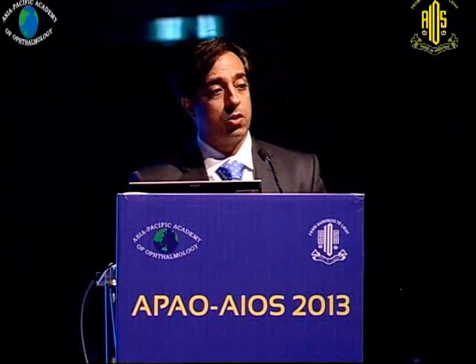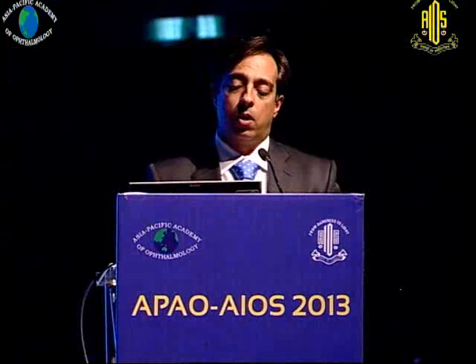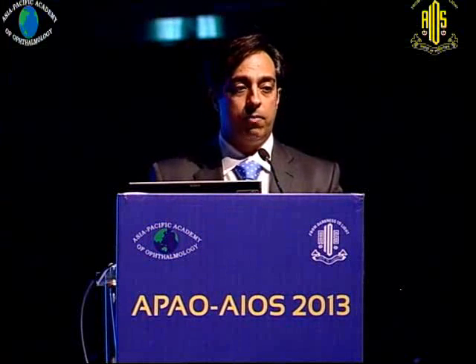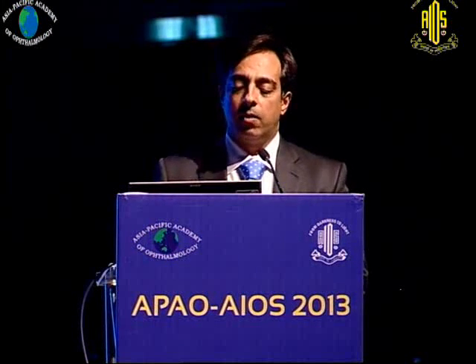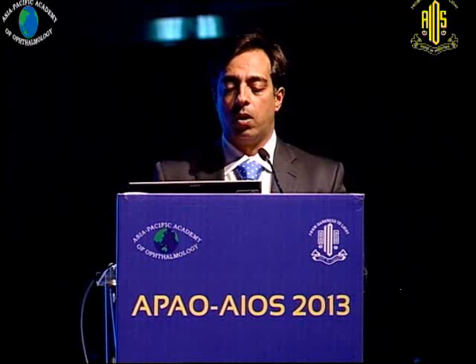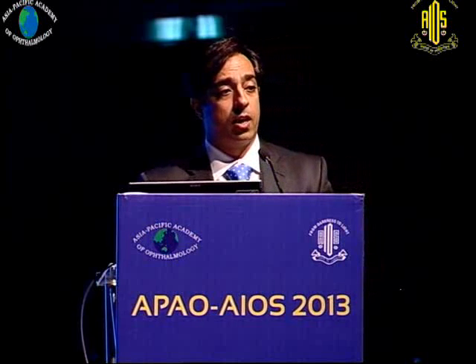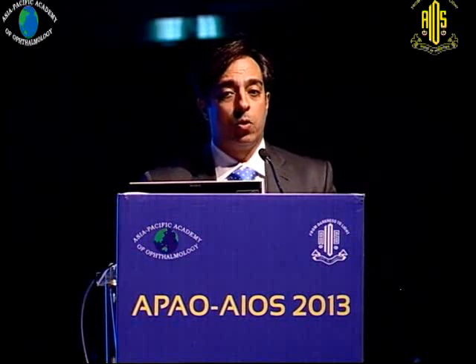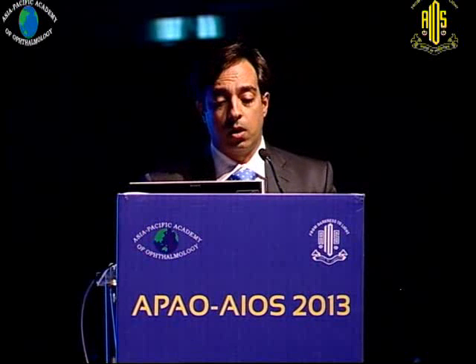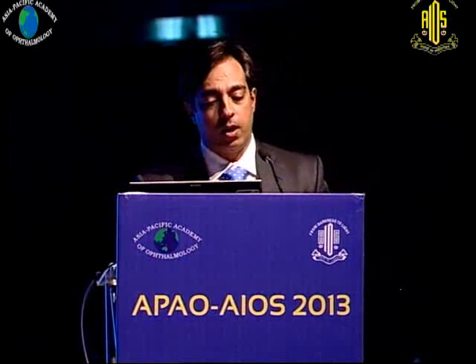Sometimes the adhesions are strong and you can rip a break or a tear there, so you don't want to do that. So if you feel that it's coming off easily without causing any major traction, then you can remove it in toto. You can see the mild petechial hemorrhages seen below, or the disc where probably the scaffold of the new vessels was connected starts to bleed a bit. So you raise the pressure, control it, and if required you need to use a diathermy to control it. So vascular conditions would behave differently.